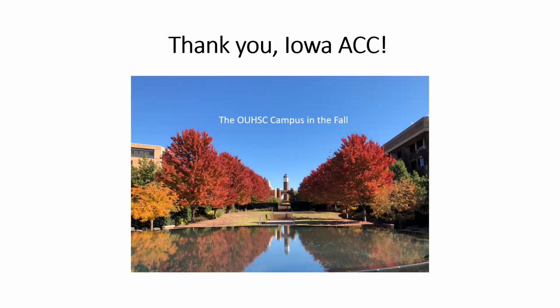One last question. Is it true that you cannot really have tamponade physiology without IVC plethora? That would be highly unusual. But here is a word of caution. A lot of times scanning patients with tamponade is very challenging, and if it is done by someone without experience, what you think is lack of IVC plethora may be a misdiagnosis. I would just say that it is inconsistent with the physiology of tamponade not to have right atrial pressure elevation, and as such, not to have IVC plethora.